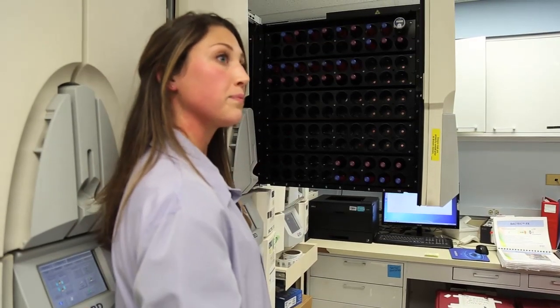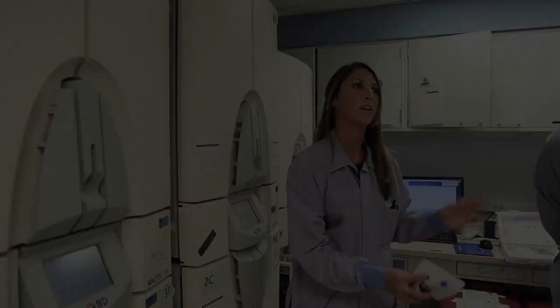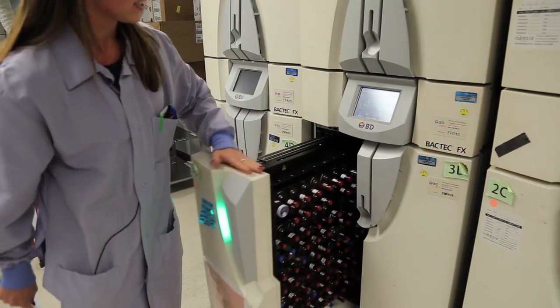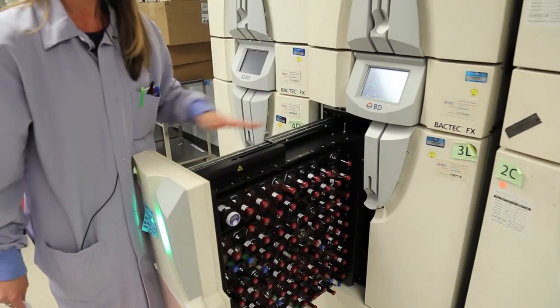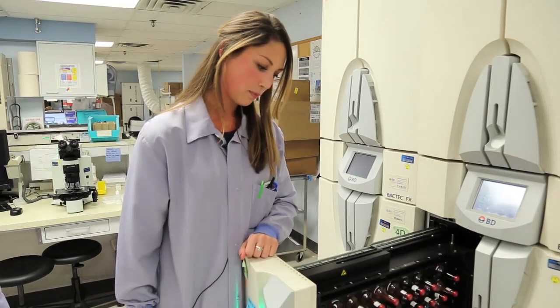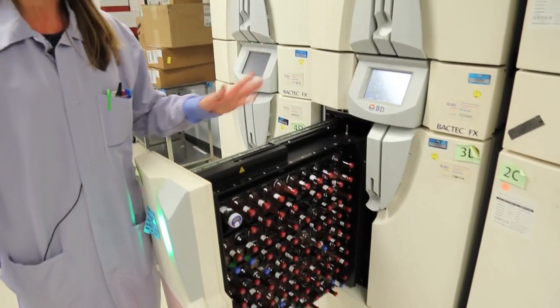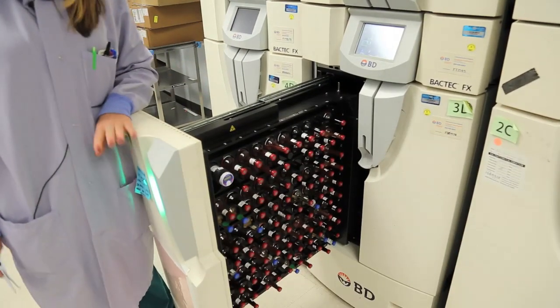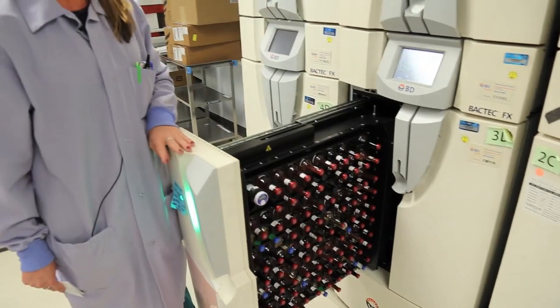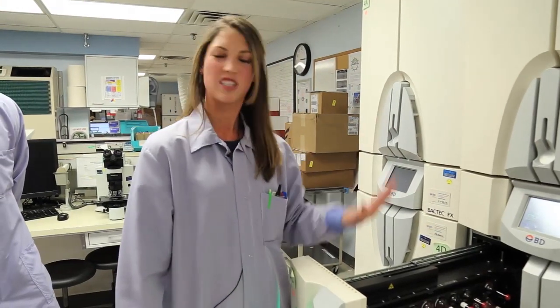So pending are the ones that, when we scanned them in, it held for 5 days. And so it's holding on to those for 5 days. So they've been negative thus far. We keep all of the fungal bottles in here, just so we keep them all in one location and we know where they all are. Now I see blue. Is that fungal and then AFB? Those are just other kind of studies. So some extra. But the rest of our patient aerobic, anaerobic ones we'll keep in these. Okay. So it's just kind of a special drawer.